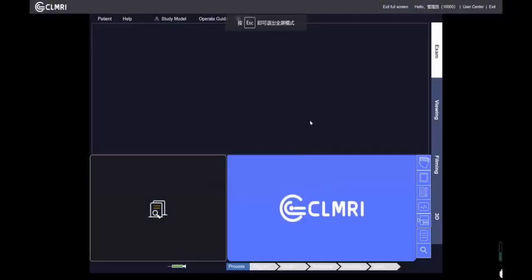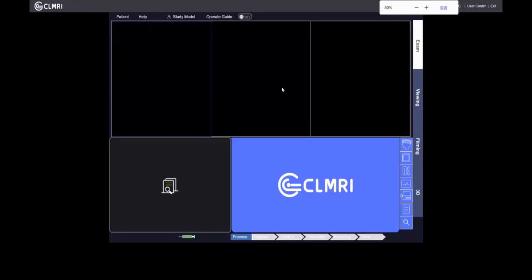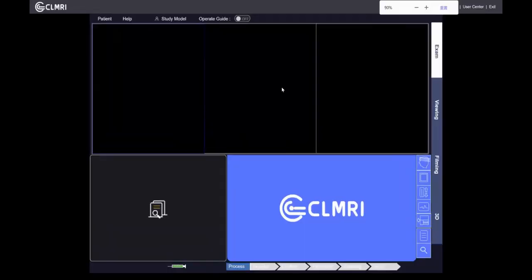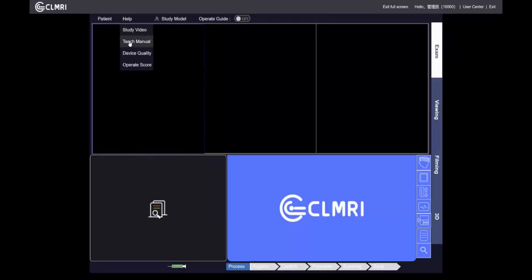Now go full screen. If your screen is not full screen, you can use the Control key on your keyboard while rolling your mouse wheel up or down to adjust your display resolution until you reach full screen. Now we can see the interface of the simulator. Here is the menu: the patient menu, the help menu — we provide a lot of study videos here — and the teach menu.